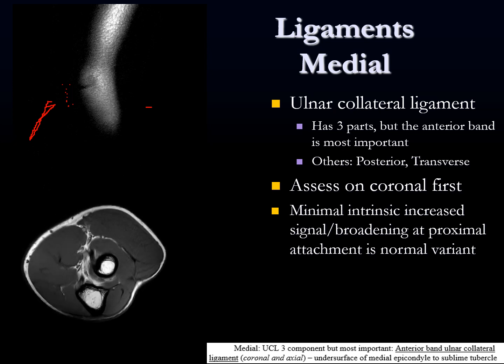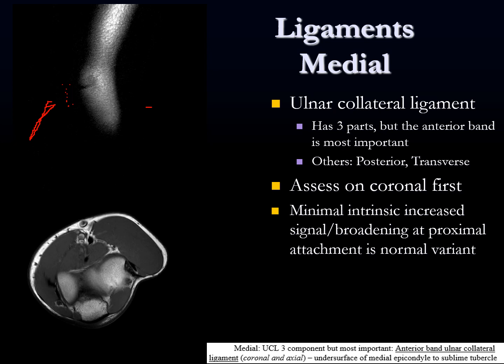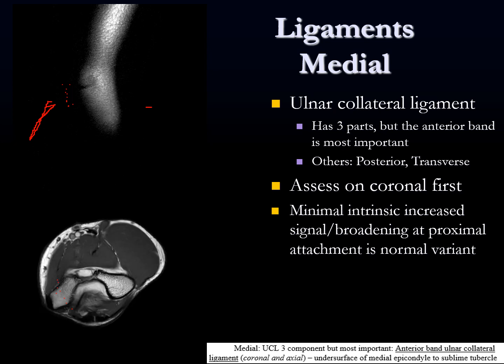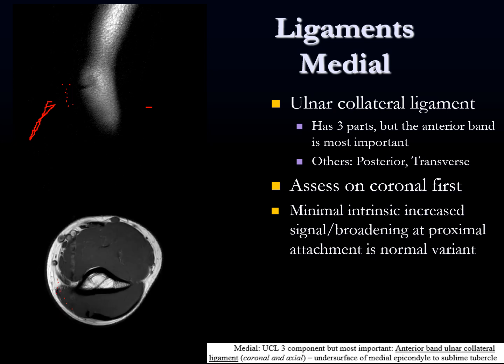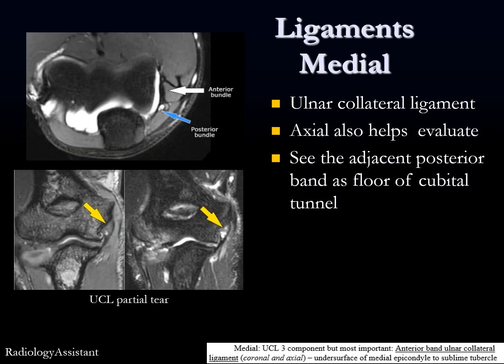Let's follow the UCL on our coronal images coming from posterior to anterior, finding it as it courses from the undersurface of the medial epicondyle to the sublime tubercle. This is a nice normal sublime tubercle attachment of the anterior band of the UCL, coming up through its mid-substance and attaching at the undersurface of the medial epicondyle with a little broadened signal — but normal. On axial, a good landmark is the cubital tunnel — the floor is the posterior band of the UCL, and anteriorly is the anterior band.